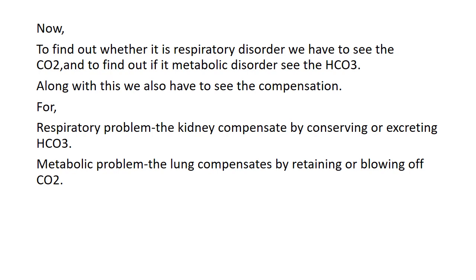The pH is acidotic, 7.2, and the CO2 is building up, that is also acidotic. So here the sample is respiratory acidosis. It is not going with the bicarbonate, it is going with the carbon dioxide. So you have to match it with the pH.